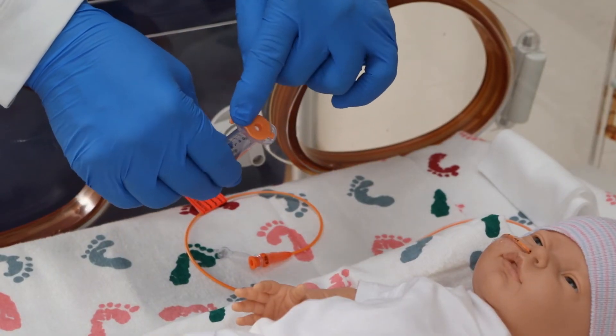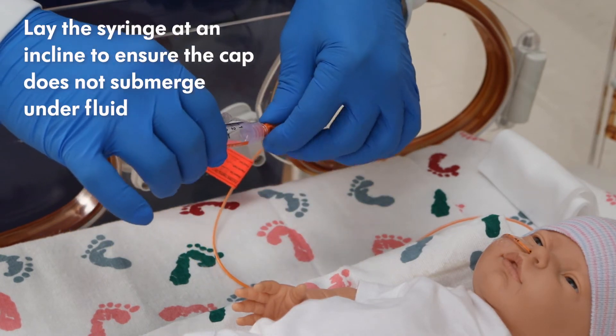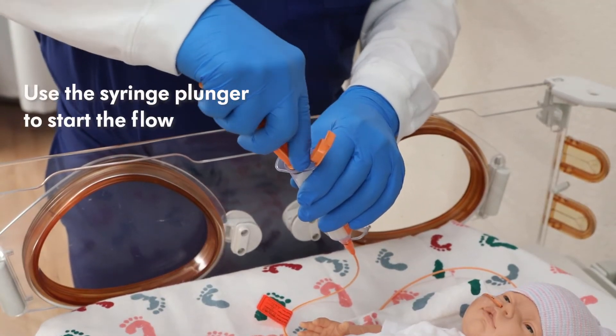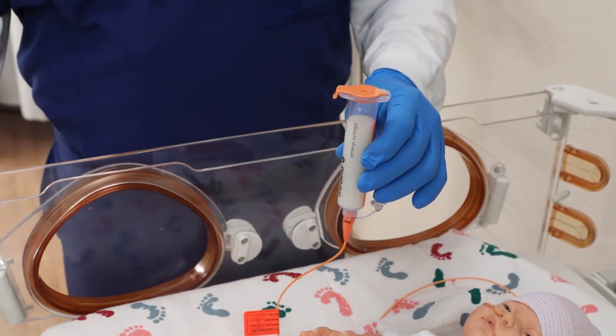For venting, snap the lid closed and lay the syringe at an incline. This ensures the cap does not submerge under fluid and block the venting. For feeding, use the syringe plunger to start the flow. Then snap the lid closed and hang or hold the Gravifeed vertically so the feed can continue.